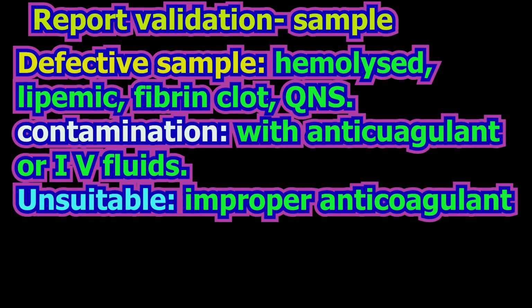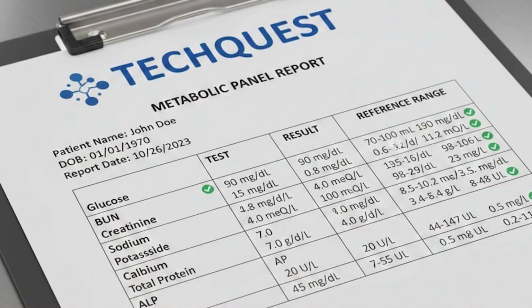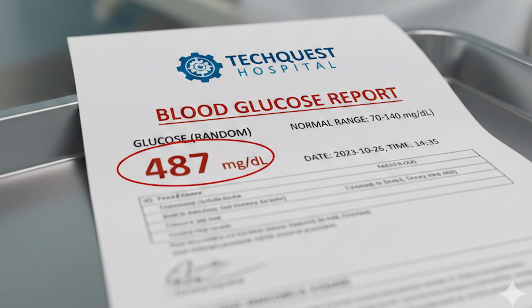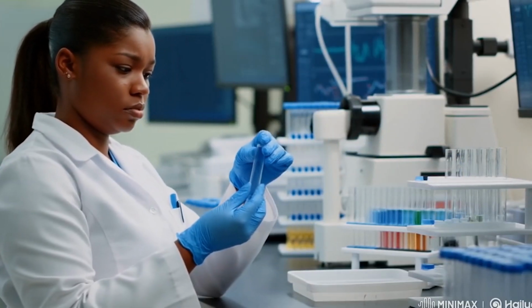The technologist must have sound knowledge of each test reference range, abnormal disease conditions, correlating other lab tests, and the lab instrument conditions. When the results are within reference range, they are reported immediately. If they are in the abnormal, critical range, for example, glucose below 50 mg per dl and above 450 mg per dl, they are repeated as per the SOP of many labs.